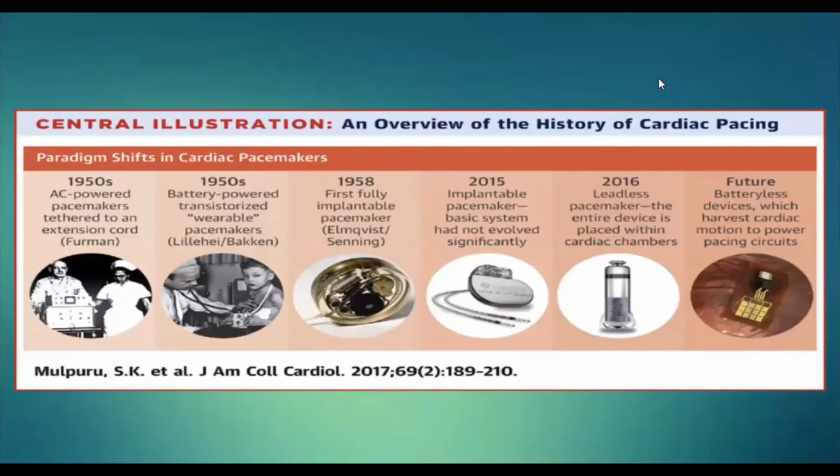And here's an overview of the history of cardiac pacing. In the 1950s, there were some studies, and the first implementation was done in 1958. Others are newer and future studies, which will be talked about later in this presentation.